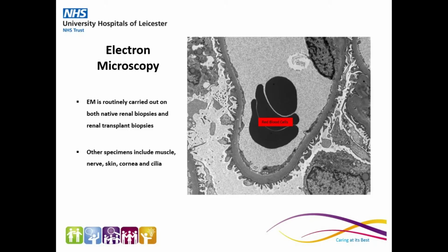Electron microscopy produces ultrastructural reports which are one piece of a diagnostic puzzle. As an ancillary test, it can provide supportive information, and in some cases it can even provide diagnostic information that no other test can.